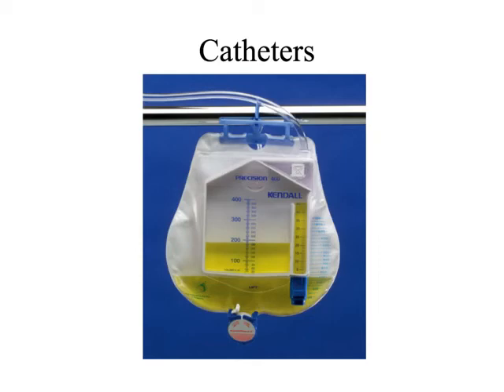One thing about catheters, as a CT tech, it is helpful to clamp these things off, right? It is helpful especially if the patient has had any kind of bladder cancer or if you suspect there being any kind of problems with the bladder, to go ahead and clamp this thing off, right?